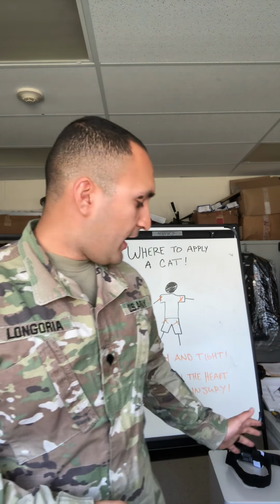The CAT tourniquet has a 96% success rate when it comes to saving lives on the battlefield. Now, with that being said, that's a tremendous number. Now, if you're in the civilian sector and you have a tragic accident occur, the chances of survival are a lot more likely than if you were in a battle zone. So I want you to keep that in mind when using this piece of equipment, that ultimately it's a guaranteed life-saving tool as long as it's used properly.